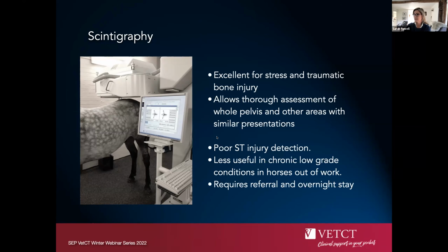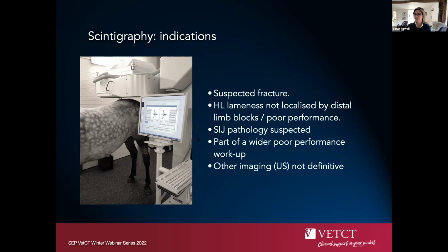Poor soft tissue injury detection, obviously, and it's certainly less useful in chronic low-grade lameness, certainly in older horses or those that are out of work. And of course, it requires a referral and overnight stay, so it's not quite as accessible.